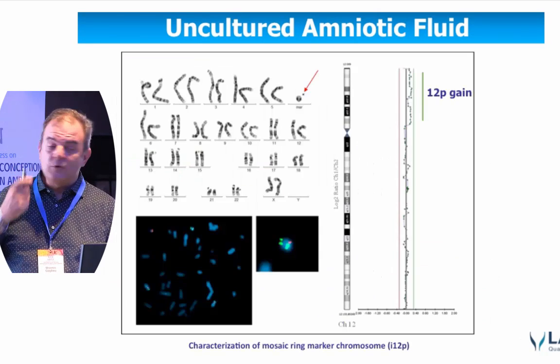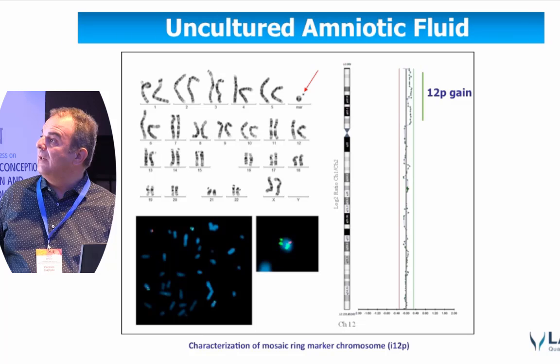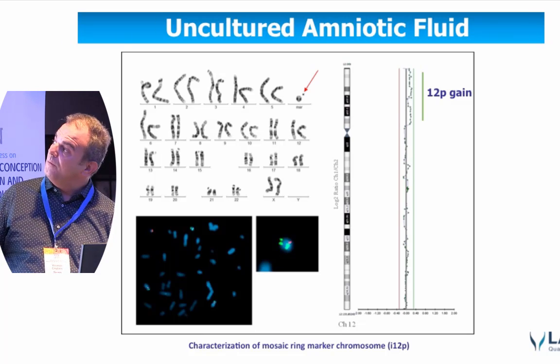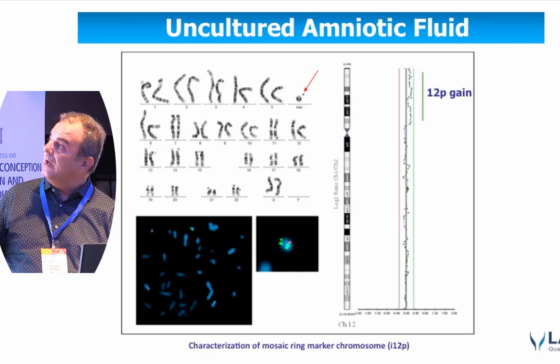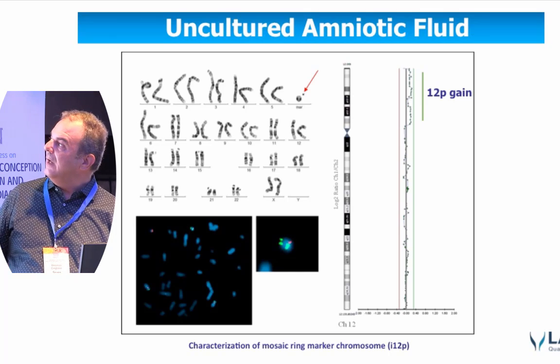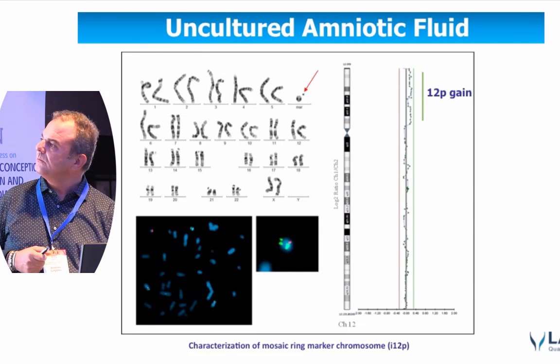And because you are analyzing the whole genome, you can also use this to identify things that you would not expect to find, like this very rare case of mosaic ring chromosome identified by microarray, which has been shown to be isochromosome 12p, so cause of Pallister-Killian syndrome. And you can see how you can also detect these mosaics, or those low-level mosaicism, with the microarrays.